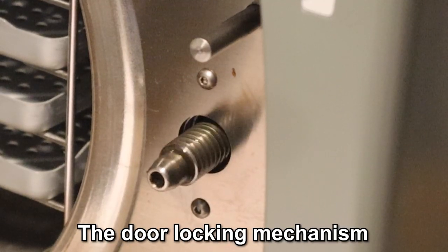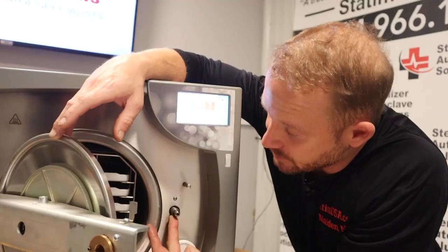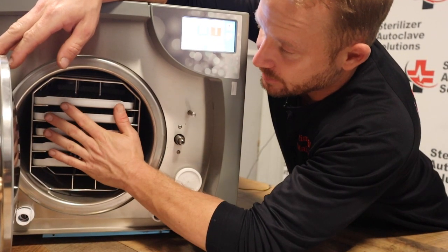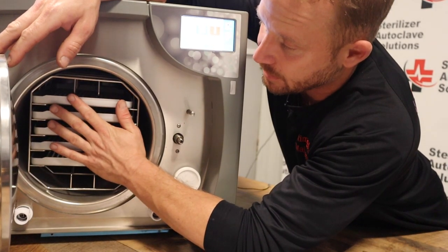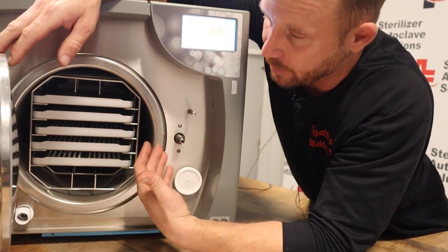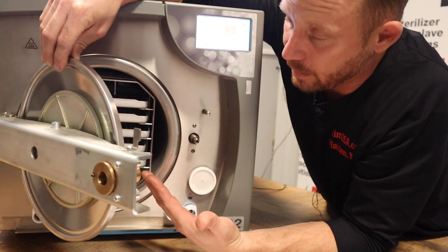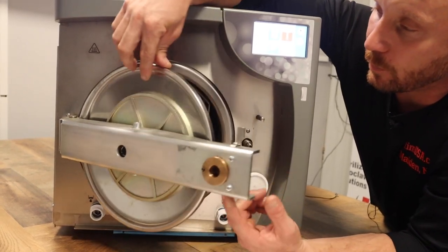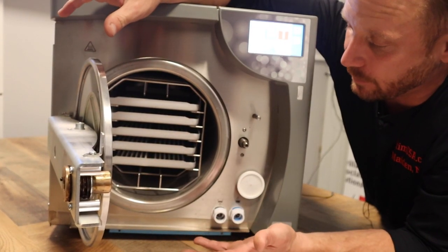This is the door locking mechanism. First thing that we can do is, number one, make sure that all your trays are pushed in. Make sure all the instruments are in there — nothing is dangling outside of the chamber, causing the door not to shut all the way. Also, in most cases, there's a plastic cover on the door. Make sure that that is not falling off or dangling.